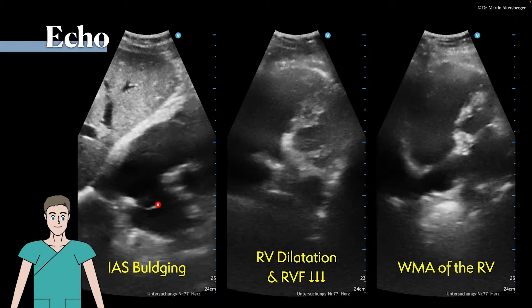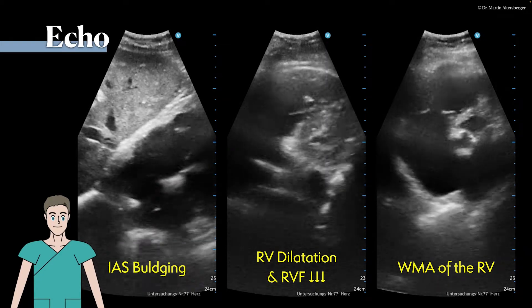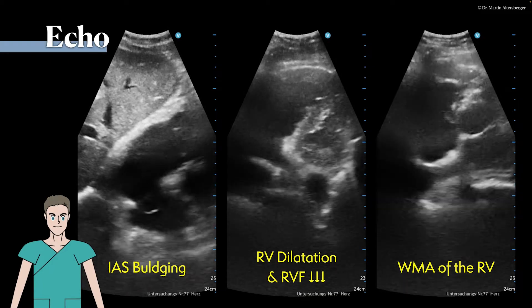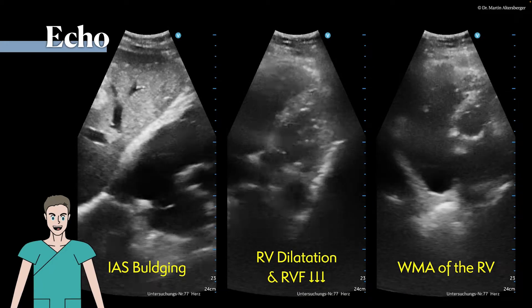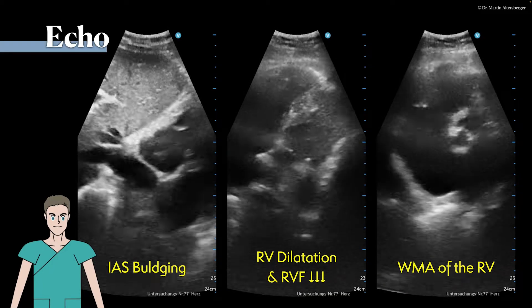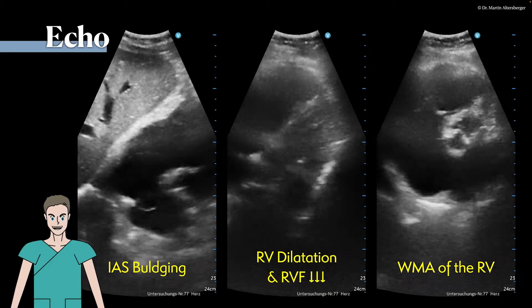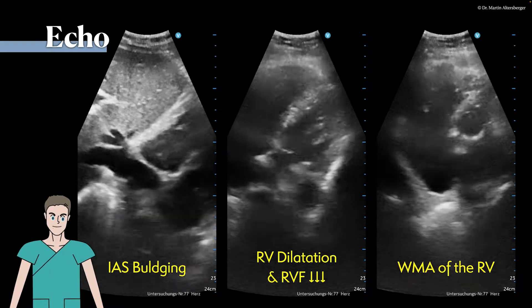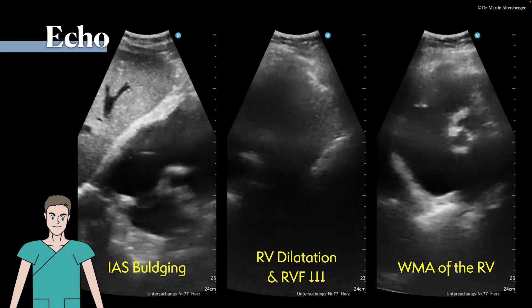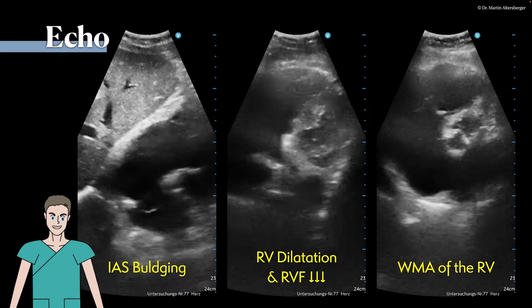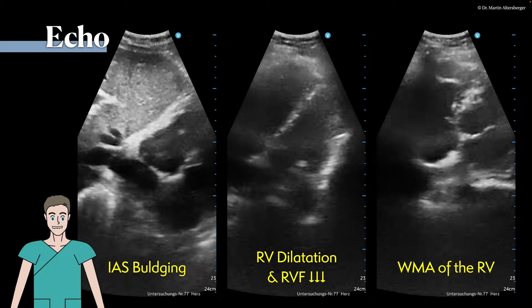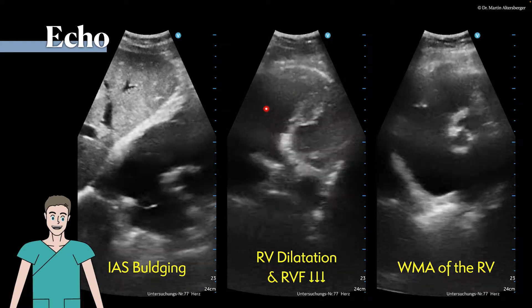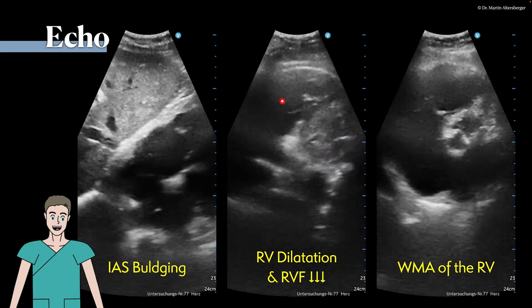So it's moving a little, but already in this first view we can appreciate that the problem has to be more in the right chambers. When we move on and scan more of the right heart and also of the left heart, we can see that the right ventricle is severely dilated.